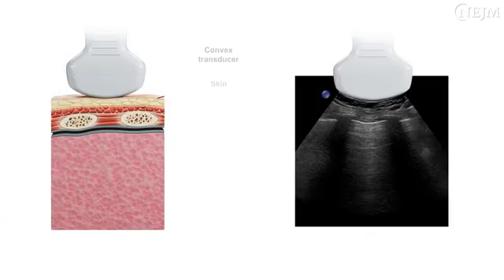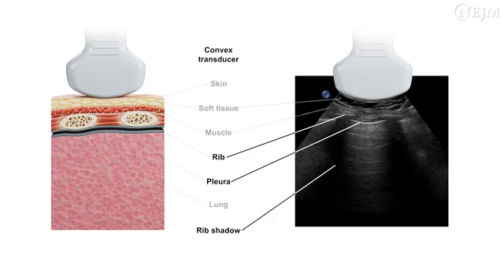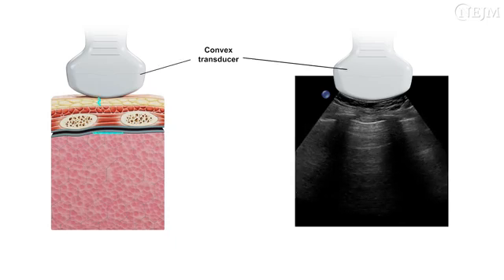The view acquired during lung ultrasonography is contained between two adjacent ribs, beneath which the pleural line can be visualized. The acoustic shadowing caused by the two adjacent ribs is called the BAT sign. Healthy lungs contain a substantial amount of air that transmits ultrasound waves very poorly, with most of the air reflected at the air tissue boundary.